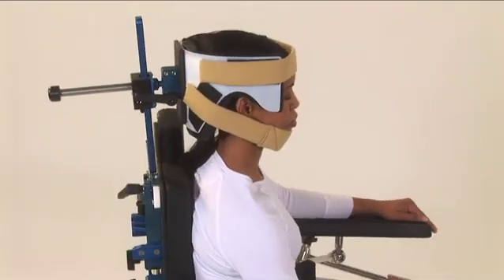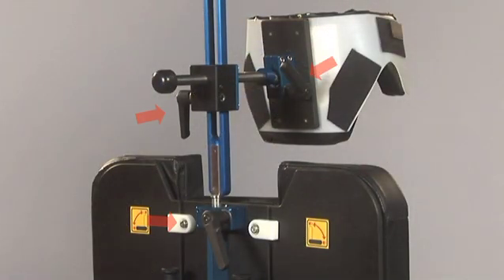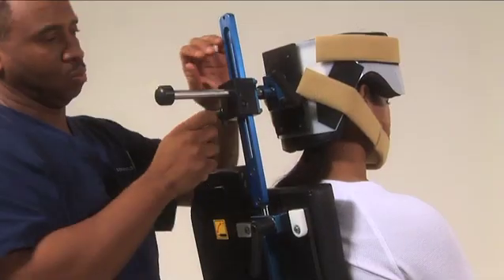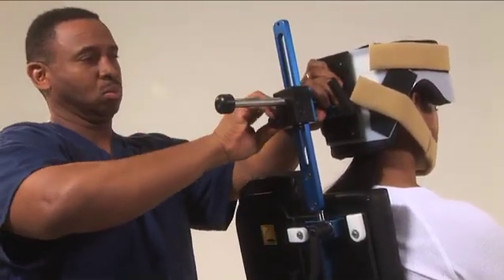The head brace gives the surgeon total positioning control of the patient's head for the procedure. To operate the head system, there are three adjustable and locking handles: two for the double ball joint positioning and one for the slide and lock control.